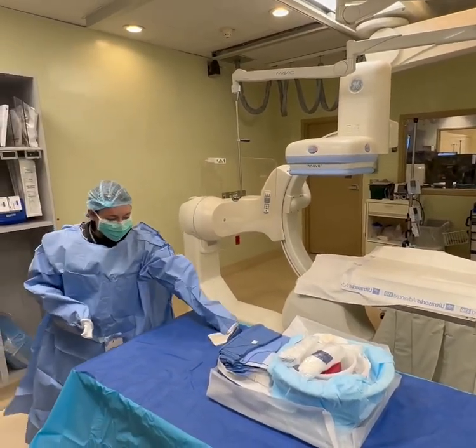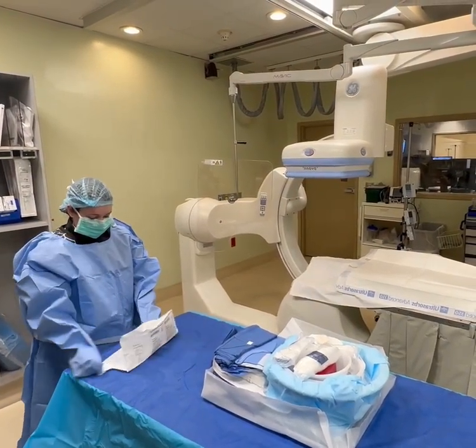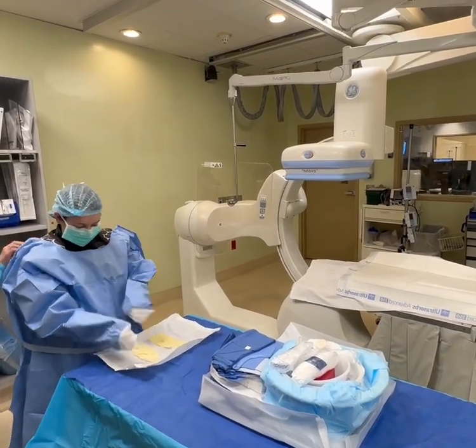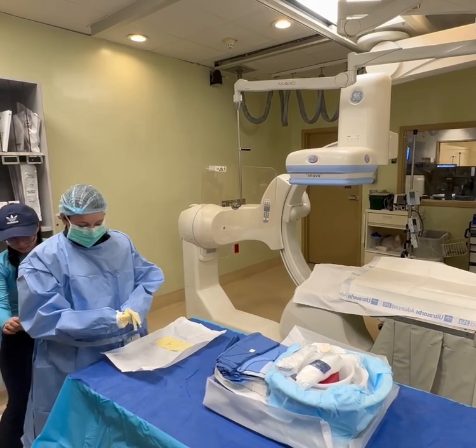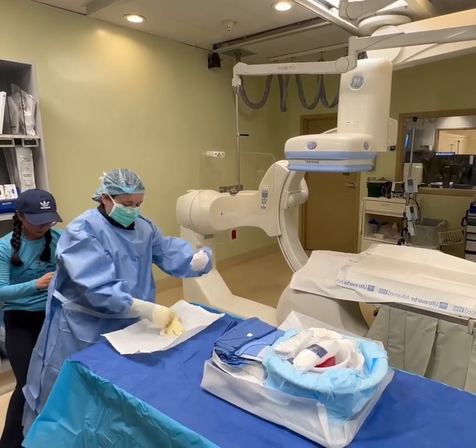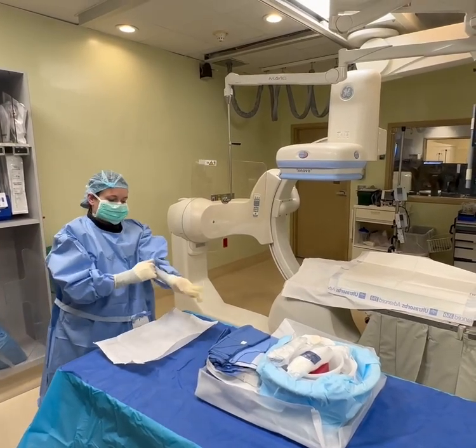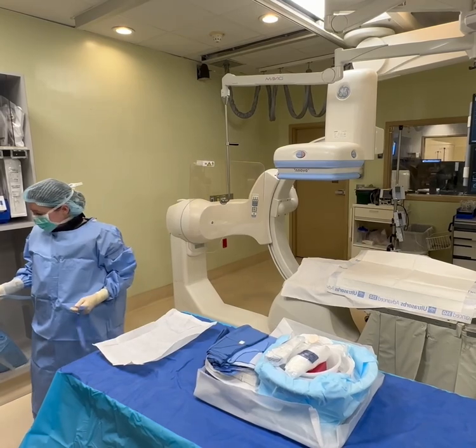My circulator or a teammate's going to come help tie me up. Okay. I'm going to do closed gloves. Closed gloves is my hands stay inside of the little cuff. I can go ahead and put it right down. Open gloves, they would be outside the cuff. Okay. Somebody's going to dance with me.